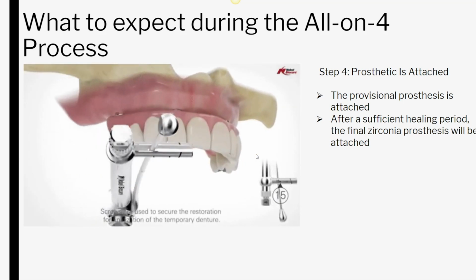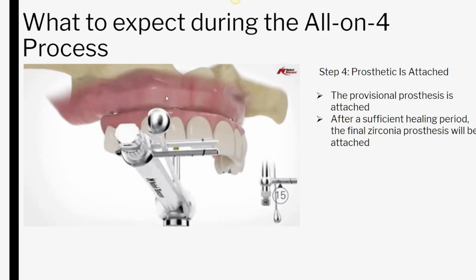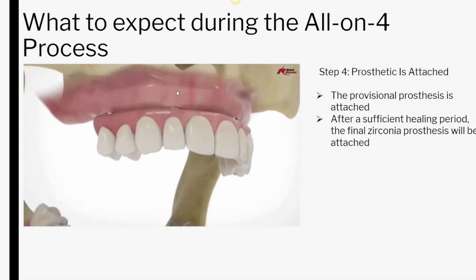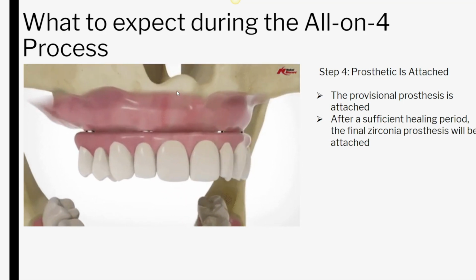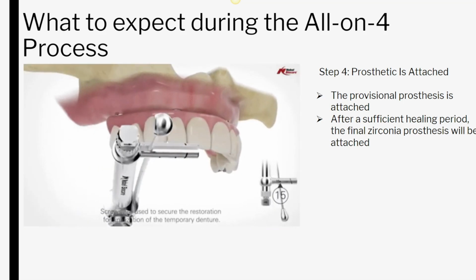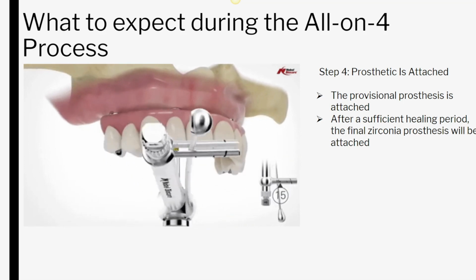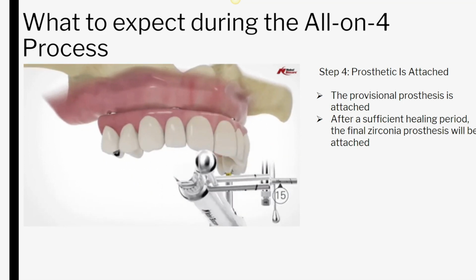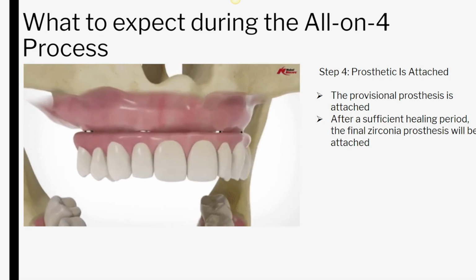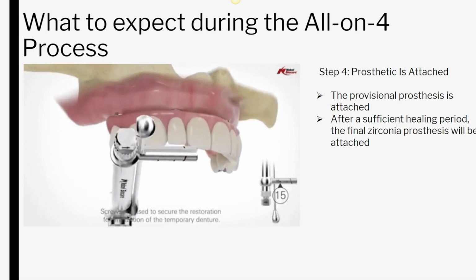The reason why we wait 4 months is we really don't want to disturb the bone while the implants are healing. That process is what we call osseointegration. And what that really involves is the healing of the dental implants to your jawbone at the cellular level, right? So that typically takes about 4 months. During that 4-month period of time, we don't want to disturb this prosthesis. So during that time, you will be wearing an acrylic prosthesis. Okay, so that's what you should be expecting the day of the surgery to be going home with.